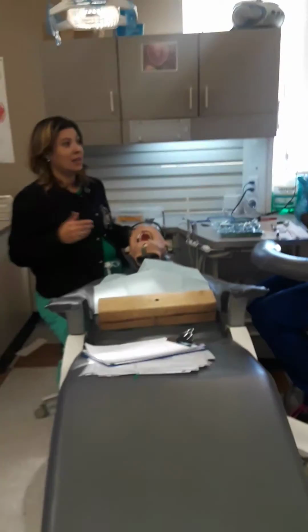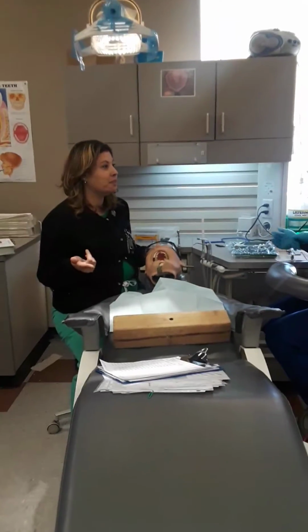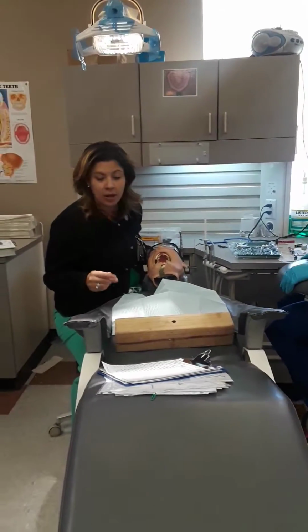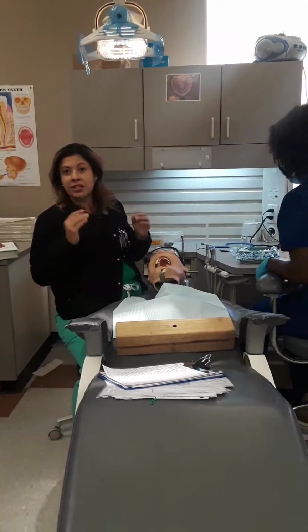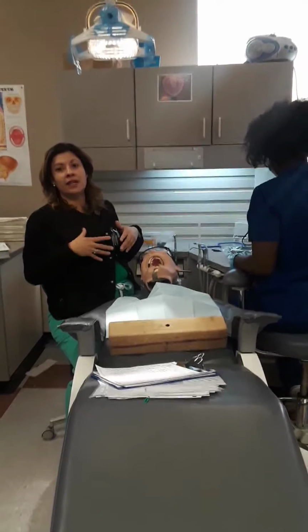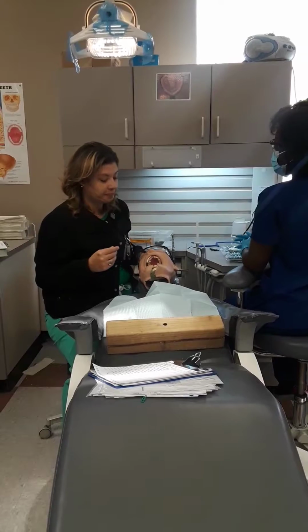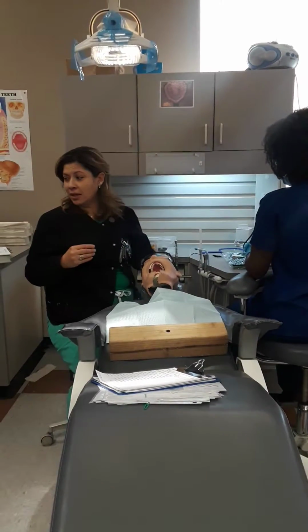Right? We got matrix bands, wedges. We have to check all that as well, stuff like that. So always remember to break your procedure down by what surface. And then as a rule of thumb, so you don't get the dental assistant curse.